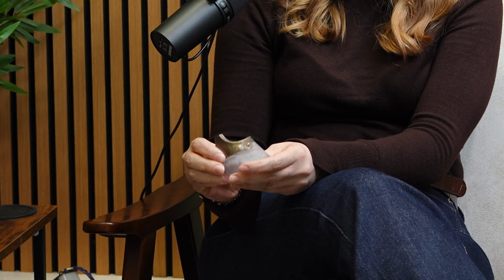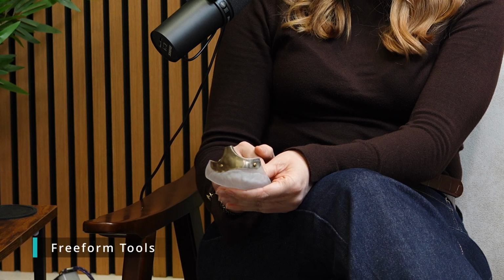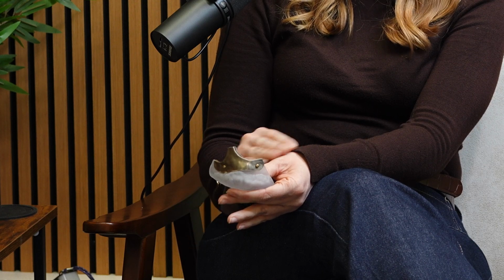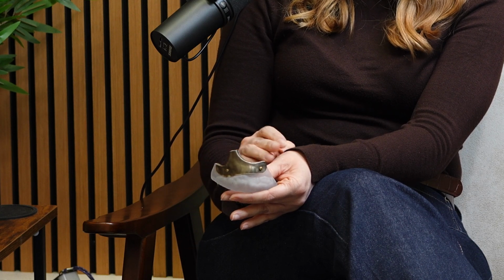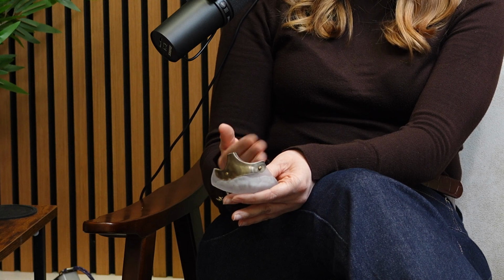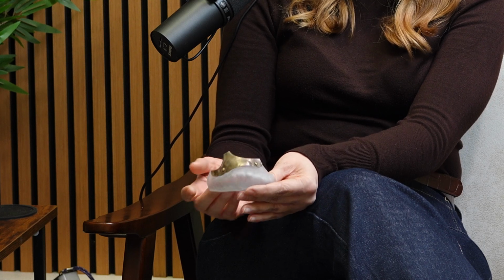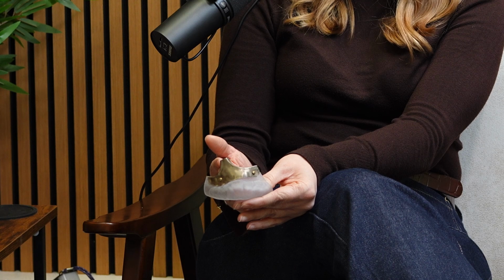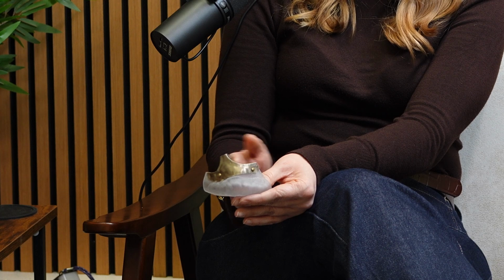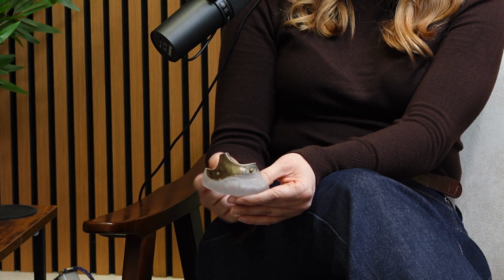Then we can do a shaped guide. To determine this shape, we can overlay the native maxilla that was there in freeform, so I can have both visible at the same time. And then I would use a plane and the sketch tool to draw a natural curve that would match that orbit that was there before, in both the nose and the eye area, and then cut this guide so that we end up with the nice curve shaped, which for this case has been covered in a titanium, just so that in theatre when they're operating it doesn't cause them to cut into the actual plastic itself. I see. It just ensures that they can do a natural curvature shape of the bone.